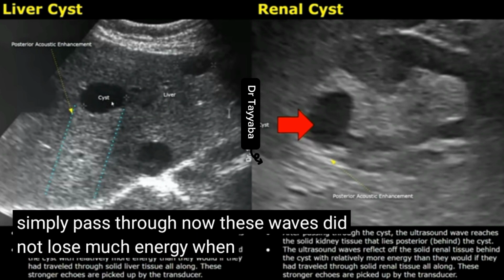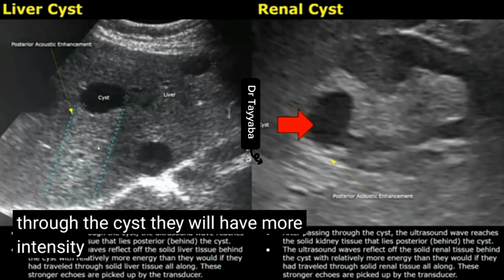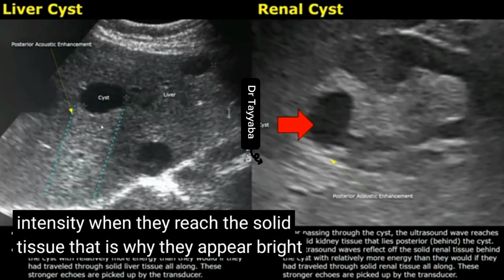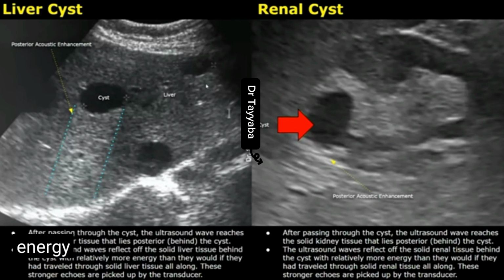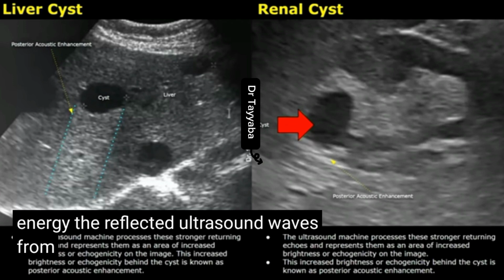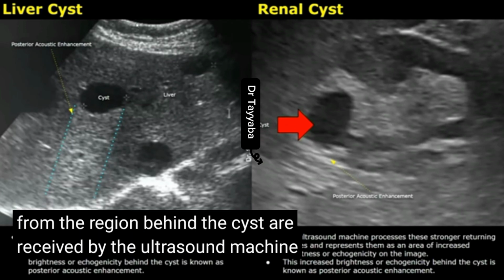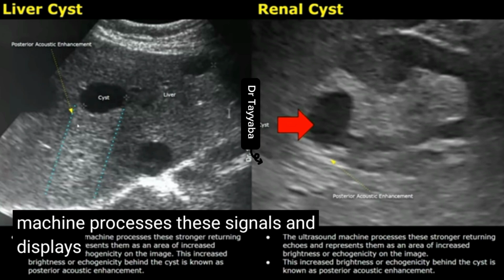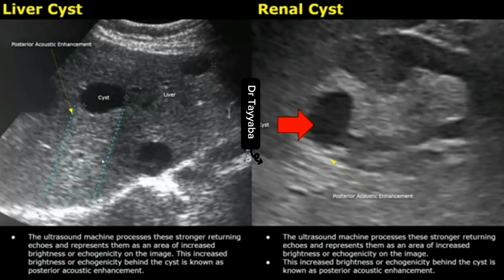Now these waves did not lose much energy when they passed through the cyst. They will have more intensity when they reach the solid tissue. That is why they appear bright, because of higher intensity, higher energy. The reflected ultrasound waves from the region behind the cyst are received by the ultrasound machine. The machine processes these signals and displays bright posterior acoustic enhancement.